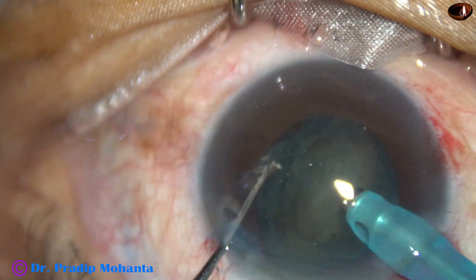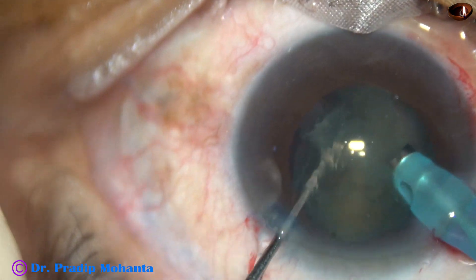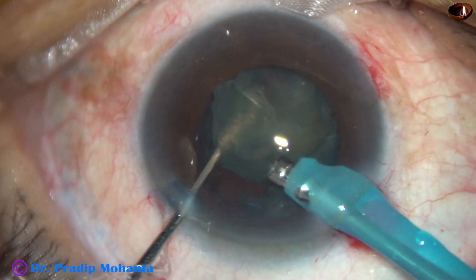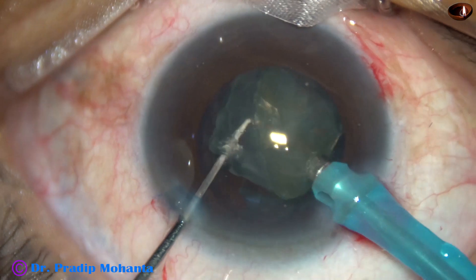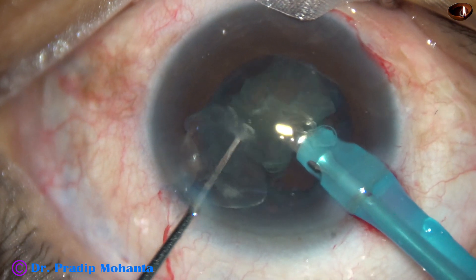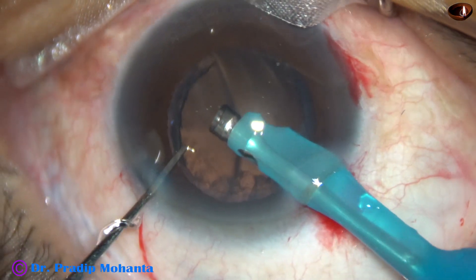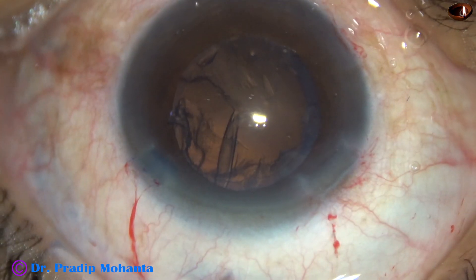And by this time, half of the nucleus is already gone. Always, this emulsification is being carried out at the iris plane. It's a very safe technique. The posterior capsule is always protected by the other equator, and there is no chance of going through the lens to the posterior capsule, because you are going through but the lens is tilted. And by this time, the nucleus is managed.